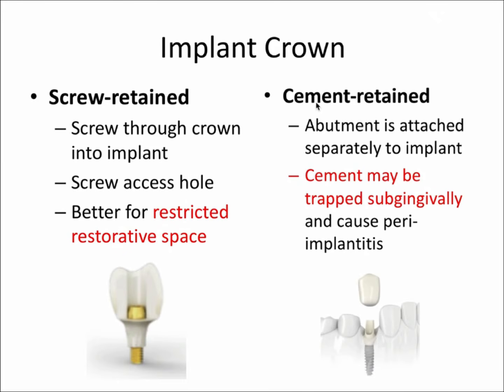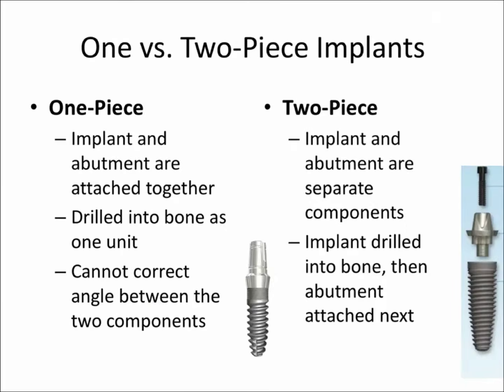And a lot of research shows that cement can be a big cause of this. So that's a big negative, and typically why it's considered standard of care after placing any implant, but particularly for cement-retained implants, to take a periapical radiograph or bitewing, so you can see if there's cement that was left over and not cleaned out after placement. All right, so those were the 4 components of implants.